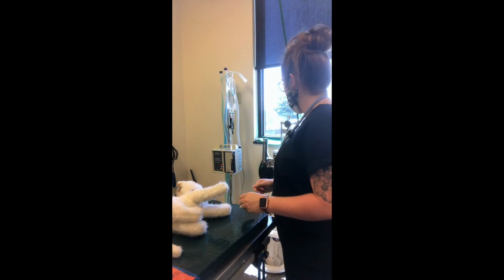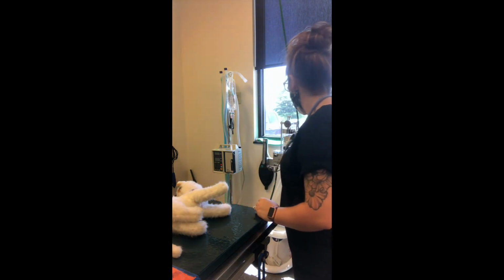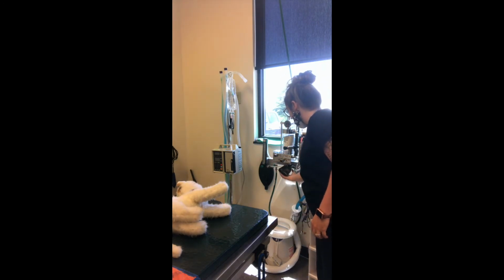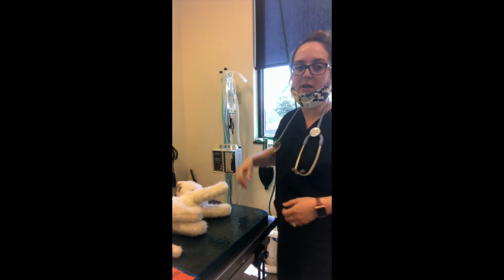And then you would want to have someone giving breaths, whether it was with your ambu bag or with your tubes attached. You can give a breath with your reservoir bag after you close your pop-off valve. You can manually give breaths that way as well.